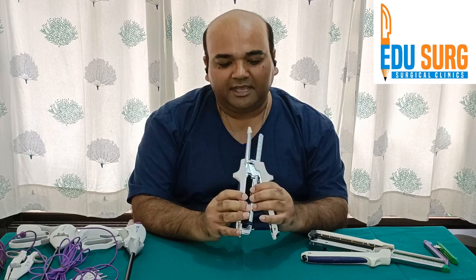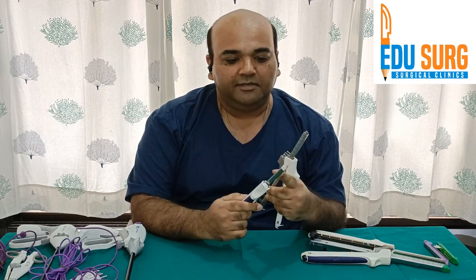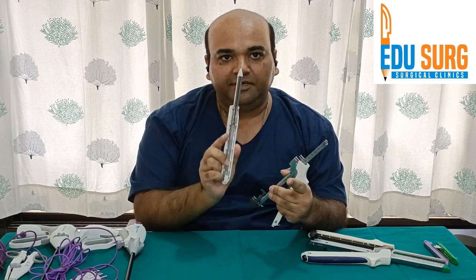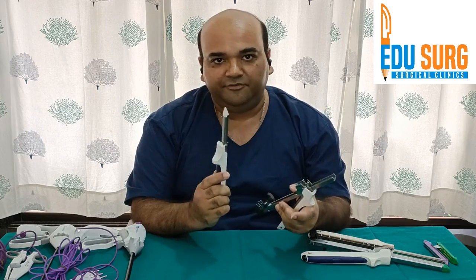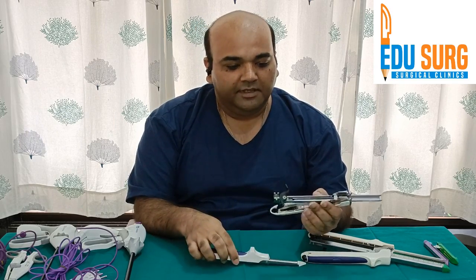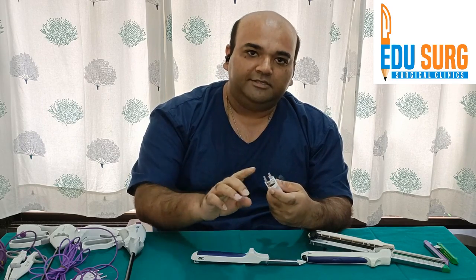This is a classical GIA stapler. It has two parts: this part where there is a preloaded area, and this is the anvil, which is the fixed part of the stapler. The other part of the stapler will load the cartridge.